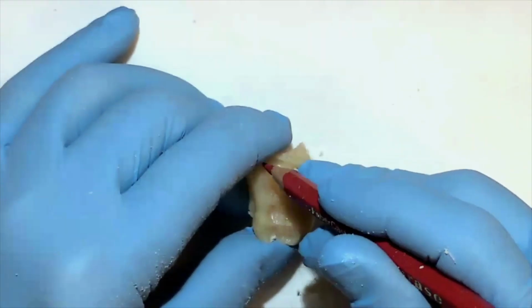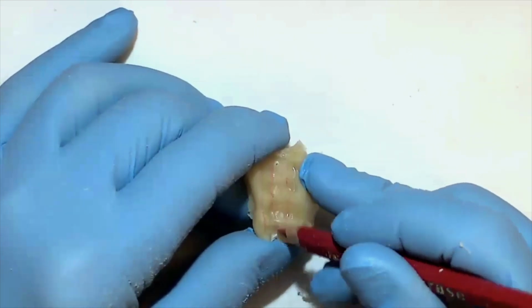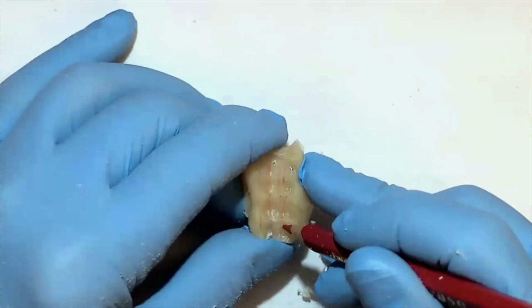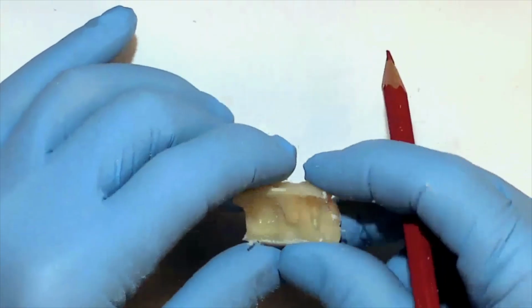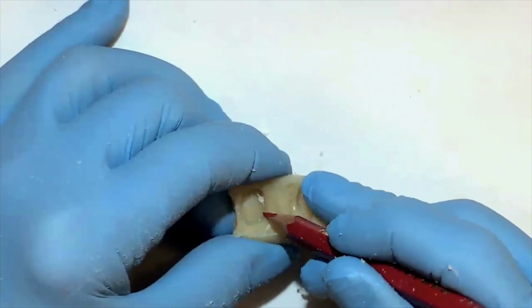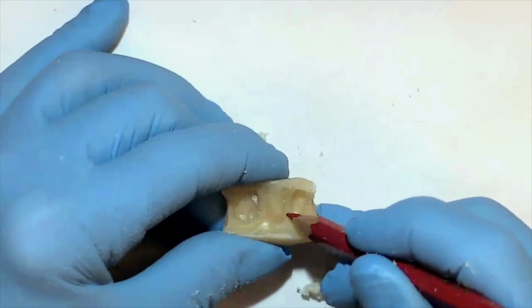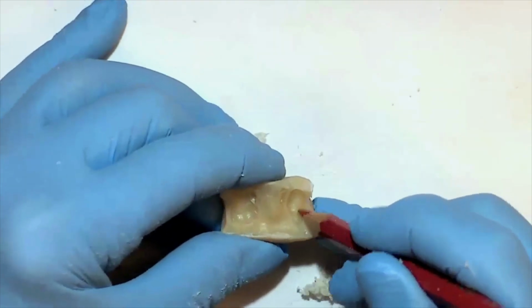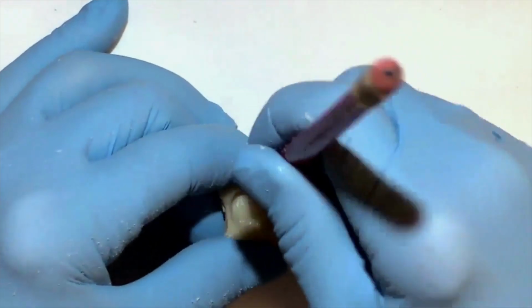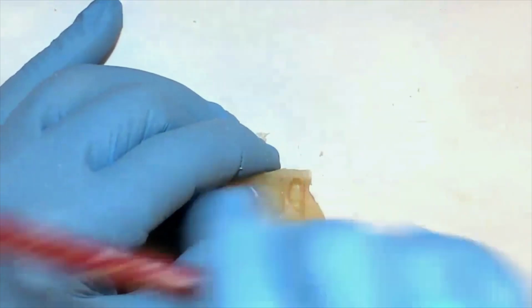Now we're going to remark our landmarks. Going to remark our central fossa line and the palatal occlusal or lingual occlusal line angle. On the inside, we're also going to mark the margins of our restorations, much as one would do when ditching dies. This will help us avoid hitting these areas as we're carving down our acrylic.